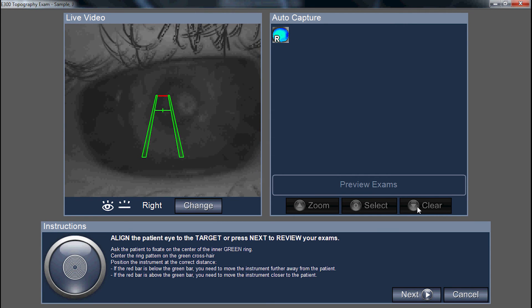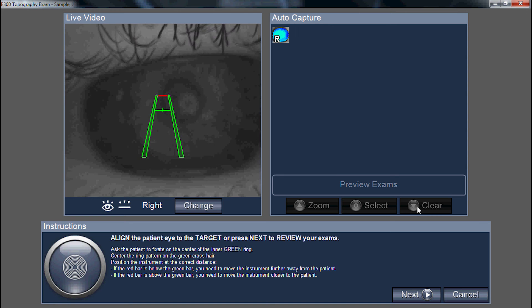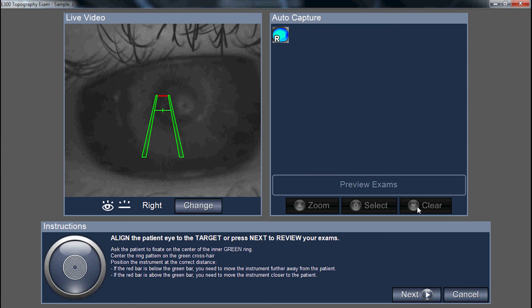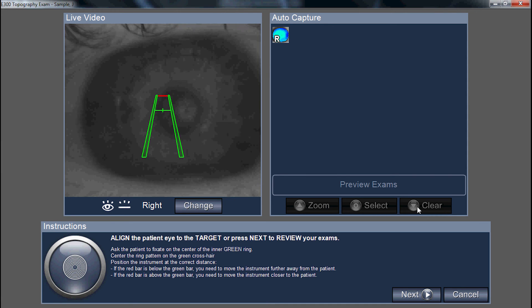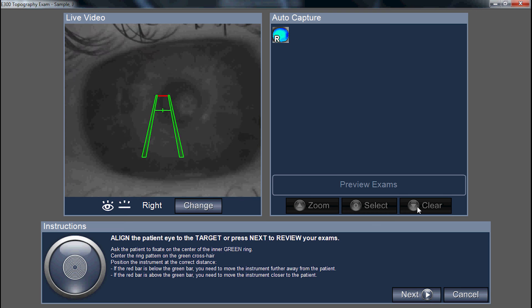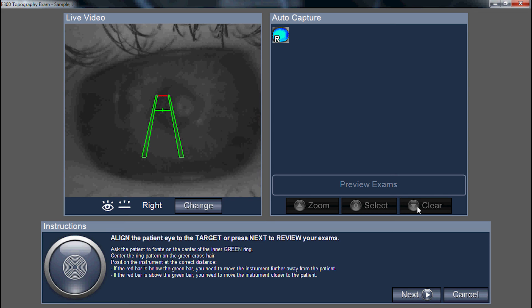If you want to change to the left eye, just move the topographer over to the opposite eye and the instrument will automatically recognize it's taking a left eye.